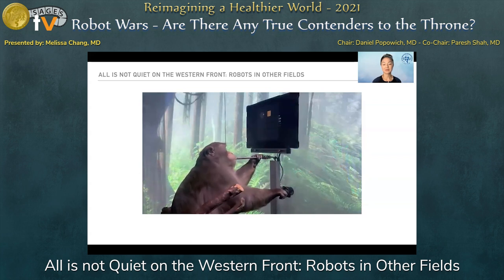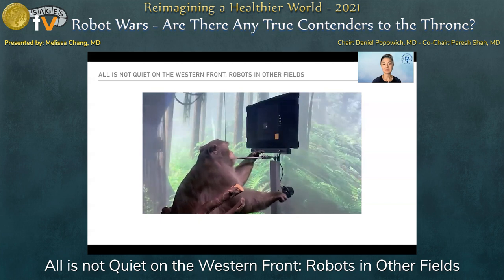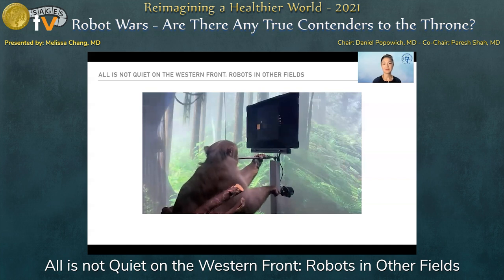The links record from more than 2,000 electrodes implanted in the regions of Pager's motor cortex that coordinate hand and arm movements. Neurons in this region modulate their activity with intended hand movement. For example, some might become more active when he moves his hand up, and others when he moves it to the right. By recording from many neurons and feeding their activity into a decoder algorithm, we are able to predict Pager's intended hand movements in real time.